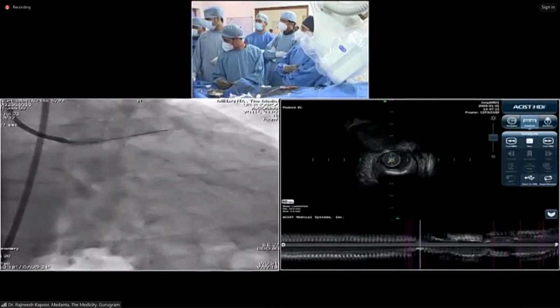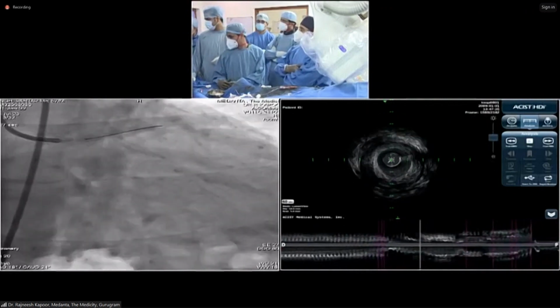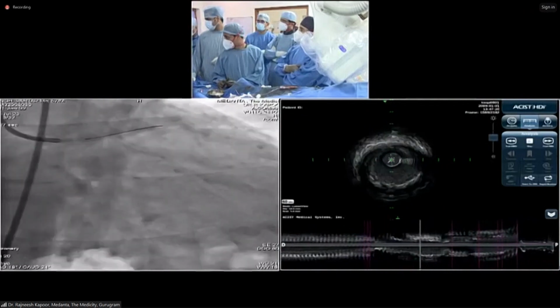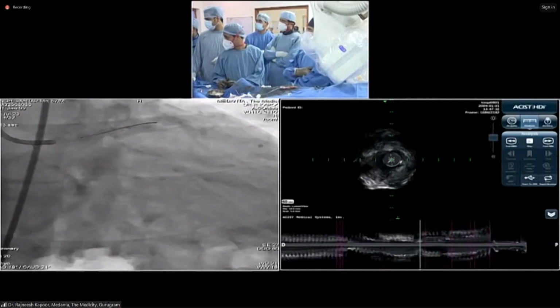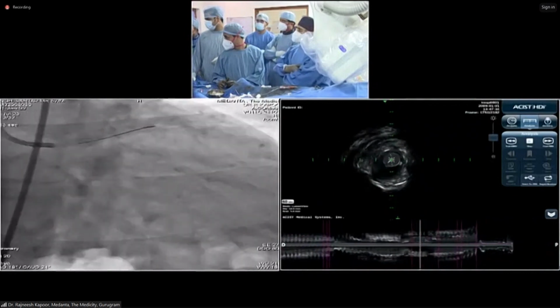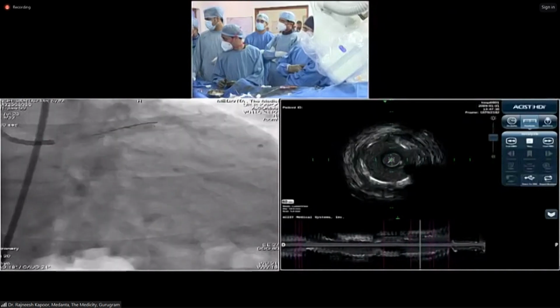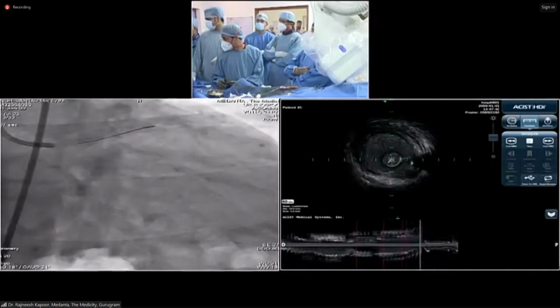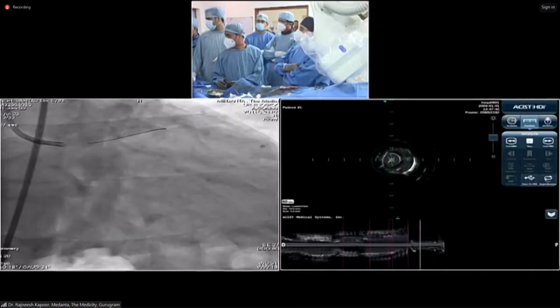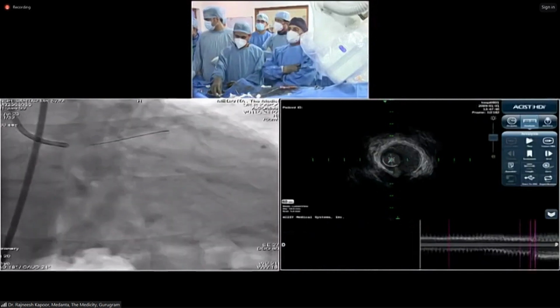There's quite a big atheroma volume. There is some calcification. We're coming back. So now LAD is better here, but now we are entering the left main. This is the stent. This is the previous stent. So this is the left main lesion, very critical, which is expanded less. At one point it is an under expanded stent. So probably that is the reason he had an ISR.